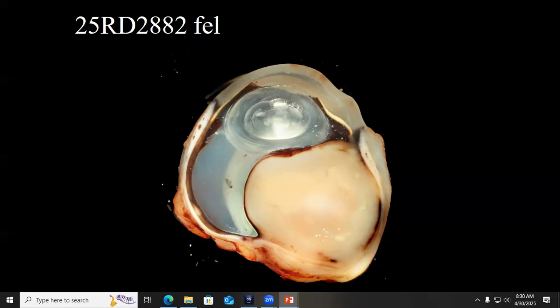So they were worried about trauma, especially a penetrating trauma and panophthalmitis or endophthalmitis in this case. So on gross evaluation, we always get to see more of the globe when it's cut in half like this. We do have a pretty cloudy and thick cornea, and then past that, there's this giant tan white expanded area involving choroid plus or minus suprachoroidal space, probably a little bit of sclera as well, and spilling out a little bit into the orbital connective tissue.